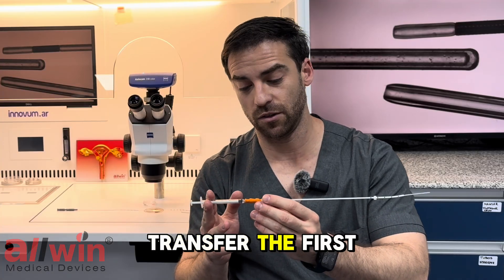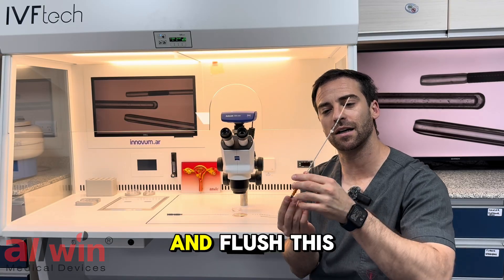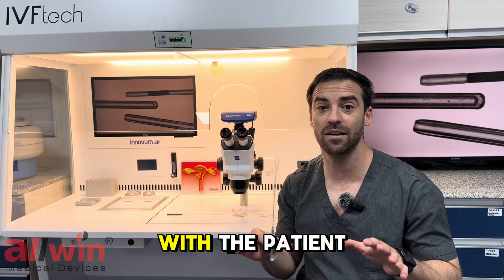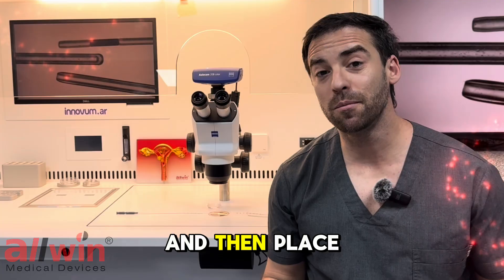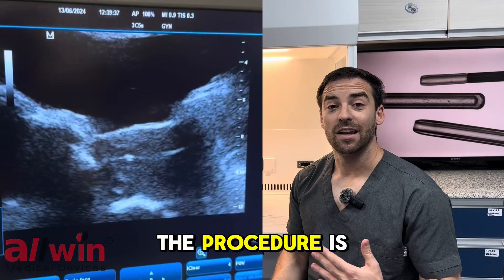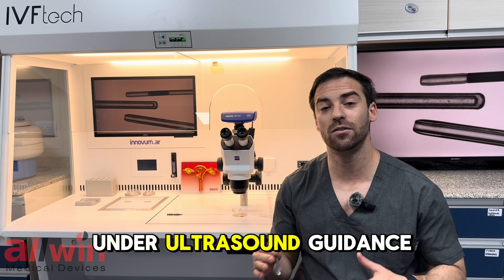For an embryo transfer, the first thing you need to do is to plug a syringe full of culture media and flush this culture media through the catheter. Now we can load the embryo and take it to the theater where the clinician is ready with the patient in position. The doctor will introduce it through the vagina, pass through the cervix, and then place it in the middle of the endometrium and flush with the embryo. The procedure is quite simple but it's crucial, so it must be done perfectly under ultrasound guidance.